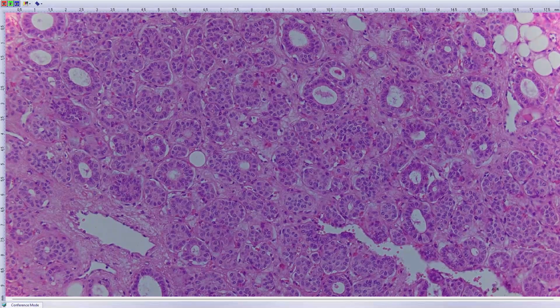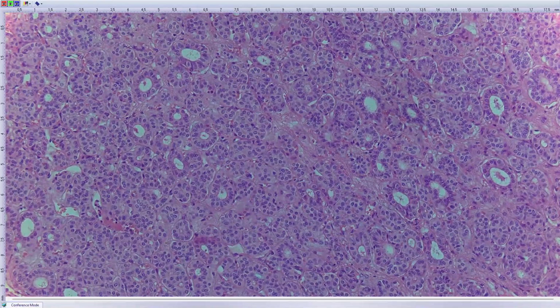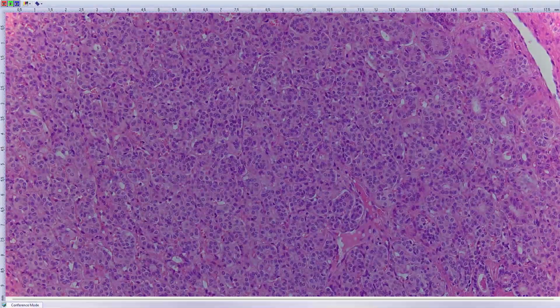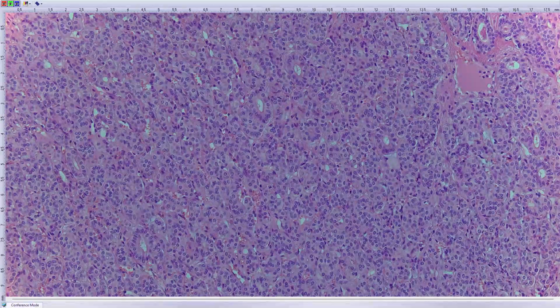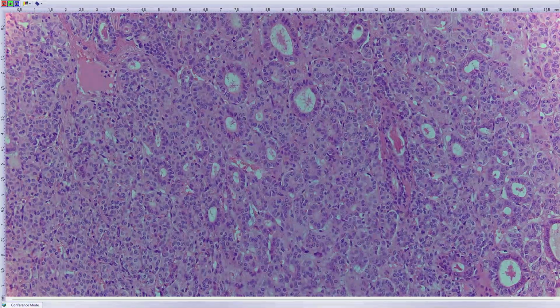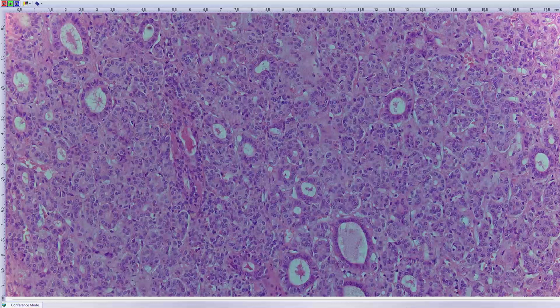not biphasic. One would expect that it's a biphasic lesion. It's completely benign, and the name is striated duct adenoma. There are two possibilities of these super rare lesions. Intercalated duct adenoma is biphasic, striated duct adenoma is monophasic. And these tumors, we are collecting them. It came from England because we would like to write about it. IDH2? Yes, it's not done so far.